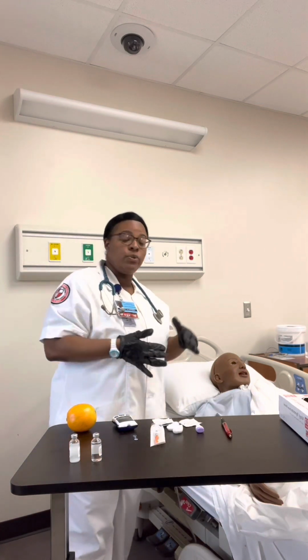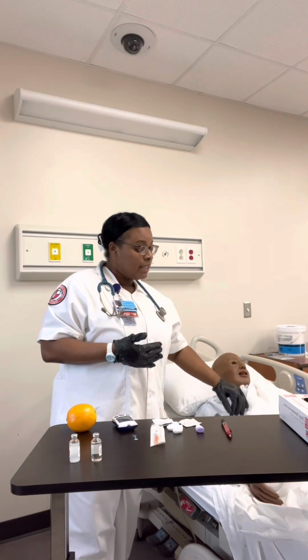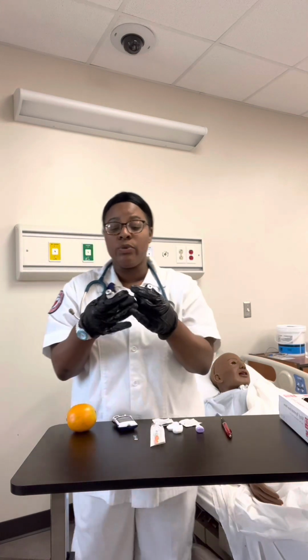I'm also going to assess the integrity of the skin. I'm going to assess the last administration site. I'm then going to compare the insulin that I have pulled with the MAR. I'm going to check the expiration date and roll the vials in my hand.